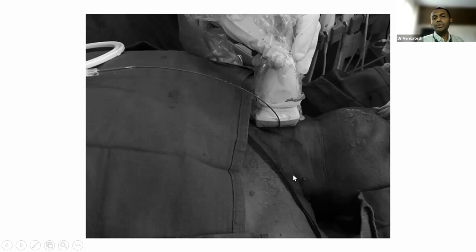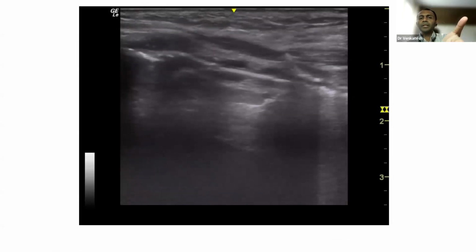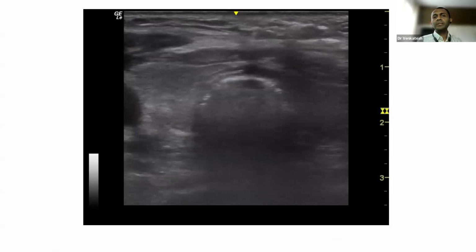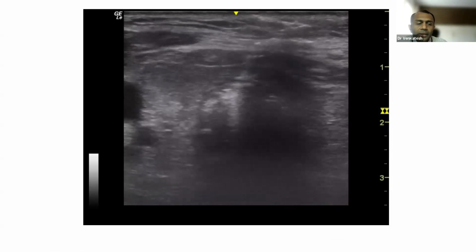This is in the longitudinal view. This is how you see in the longitudinal view where the guide wire is entering. This is in the longitudinal view again. The first one is cricoid cartilage. Next is the ring. See, I can see that the guide wire is going between the second and third tracheal rings. This is again in the transverse view, entering at the midpoint of the trachea. I think I explained 9 and 10.